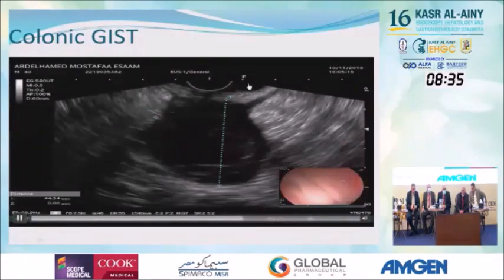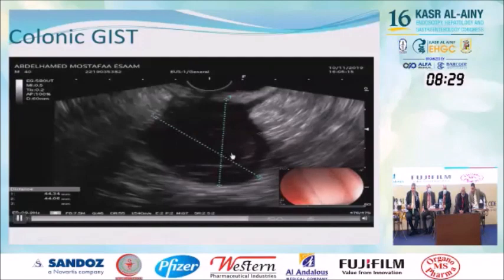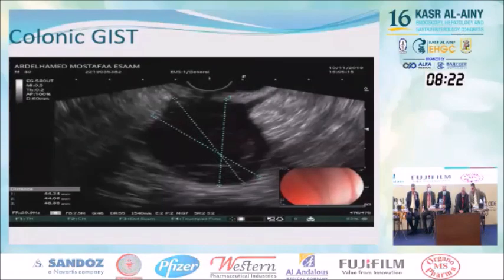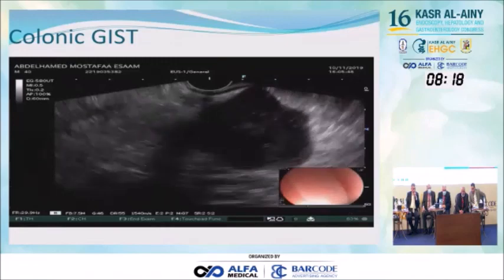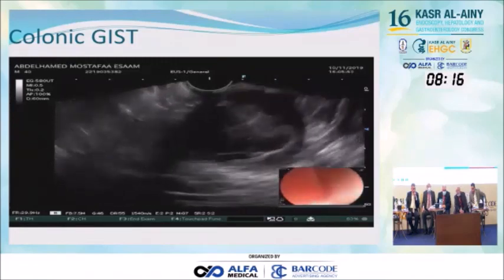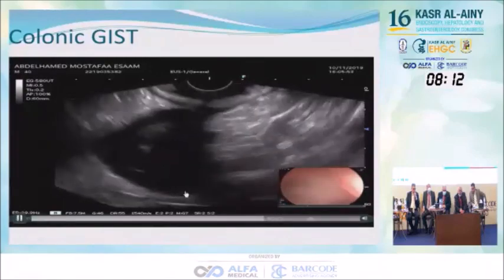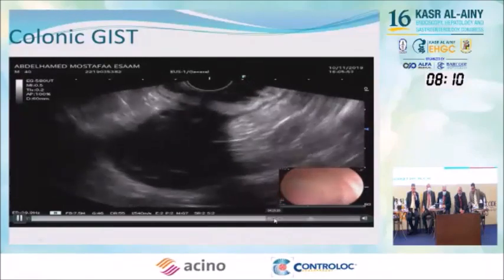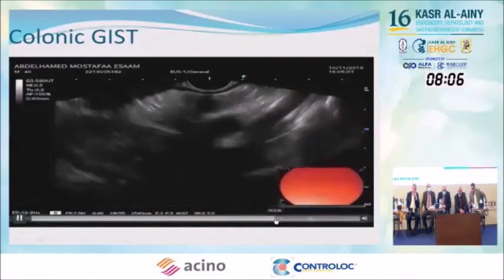So it is protruding through the intraluminal space and also to the extramural space. So it is not indicated for endoscopic management. That's a very important point. That's the point which I want to emphasize today: it is not only to show whether it is intramural or extramural, but sometimes it may be an intramural lesion that is protruding, or exophytic, to outside the wall, which is very important.